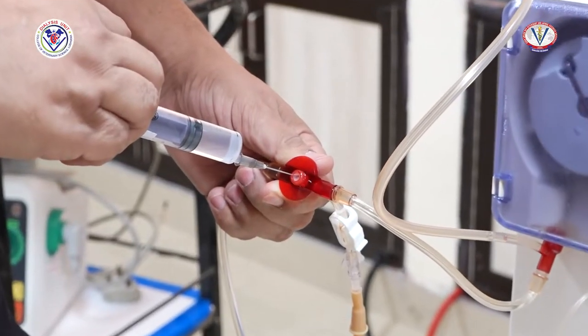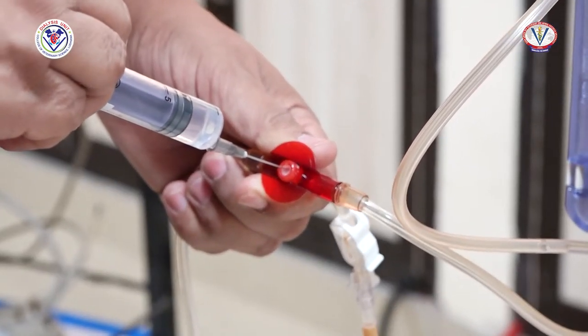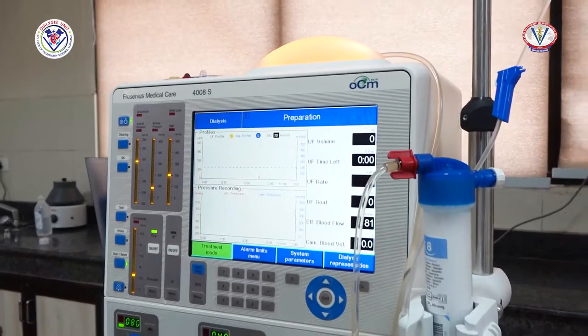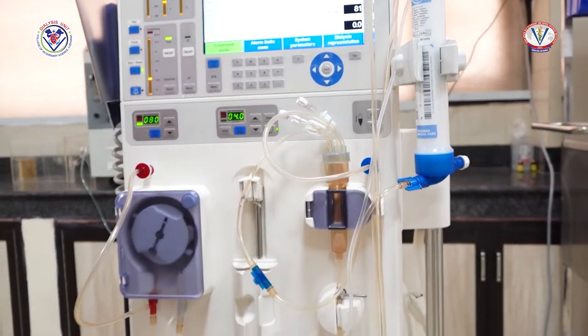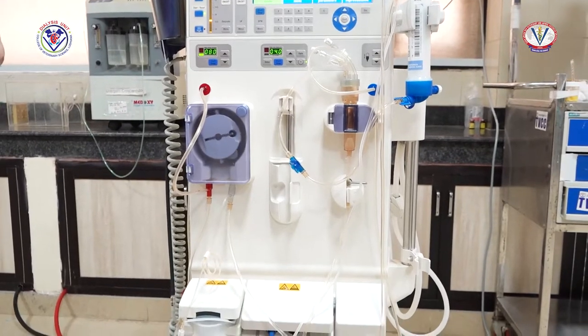Also, during this time, infuse the diluted heparin solution through the injection port in the arterial line. This heparin will circulate through the blood tubing and the dialyzer, attaching to their surfaces, and reduces chances of blood clotting within the circuit during dialysis.